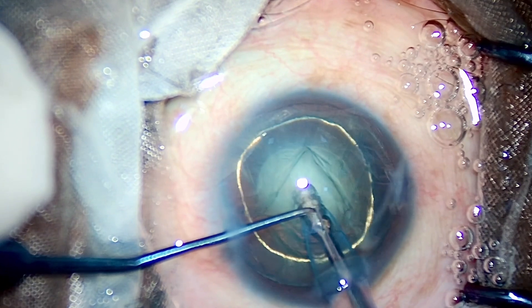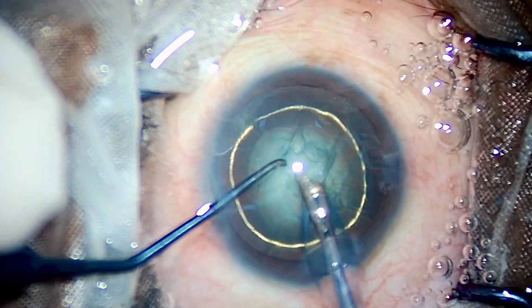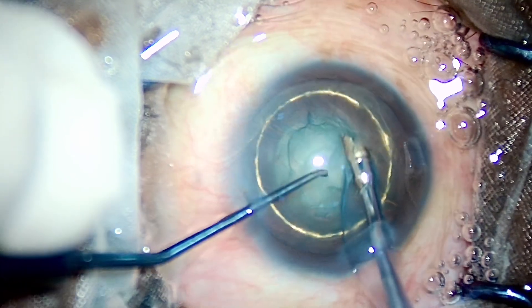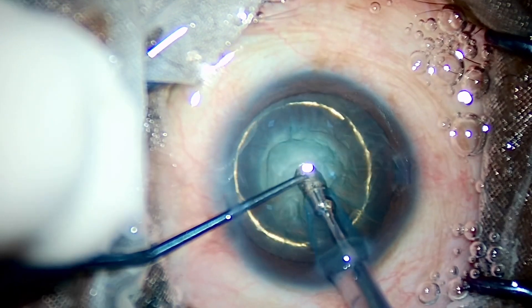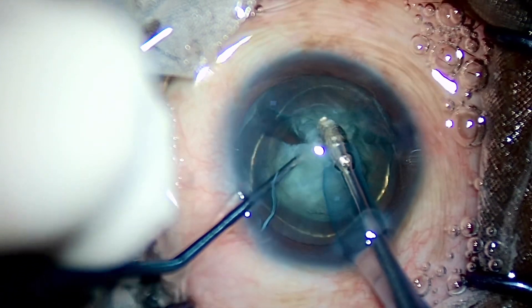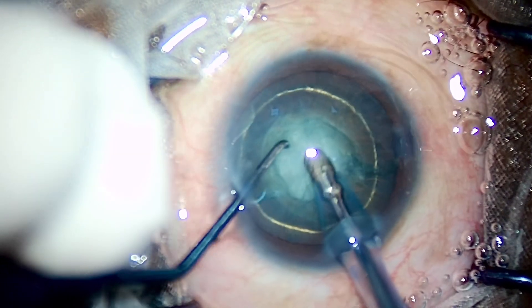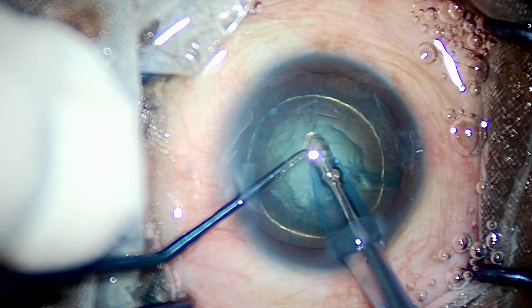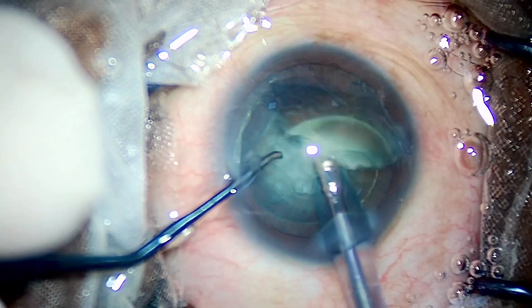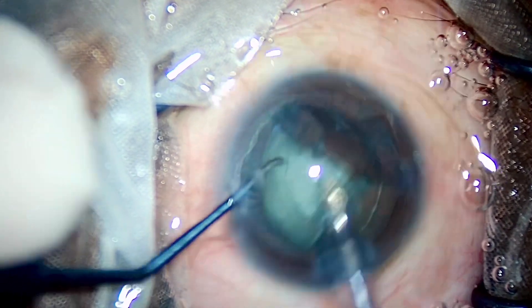I'll go down with phaco pedal three and come to phaco pedal two, trying to chop it off. At this point I realized I need to clean the cortex off a little for holding the nucleus firmly, then start again — burying deep down, chop chop chop — two pieces. I rotate the nucleus, bury my tip down once again, phaco pedal three and pedal two, chop chop chop, and yes the pieces are there. Switching to quadrant removal and aspirating those pieces — easy.